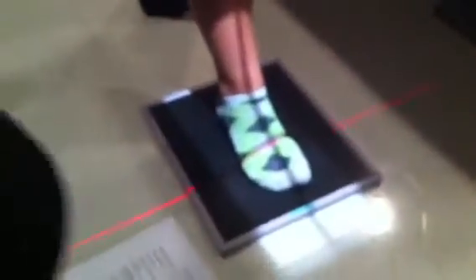Okay, so you're going to shoot this picture, and then you're going to have the patient take their other foot and step forward. And your tube is going to come behind the patient, and you're going to angle 25 degrees.